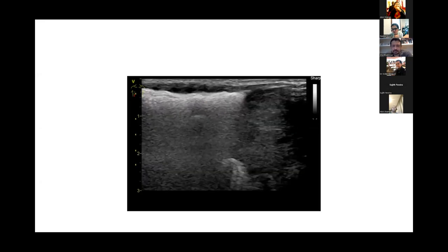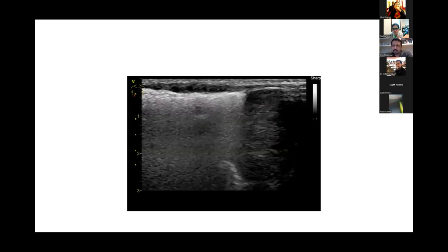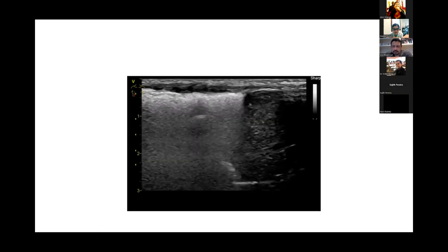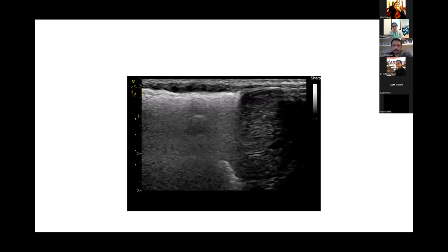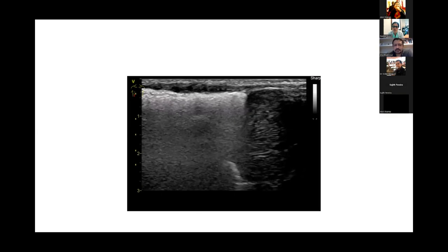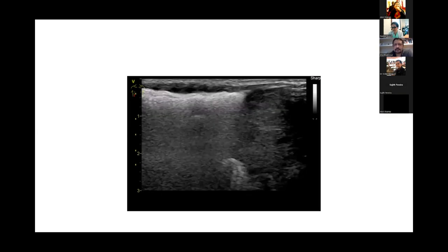And changing the frequency here would not really help you that much. Somebody asked whether we would see better with a higher frequency. Of course, the higher the frequency, the better the image you get. But is it really necessary for the lung? Not necessarily. It depends on what you're used to seeing. I'm used to seeing images with a high frequency, and in the small newborn, you're more comfortable above 10 to 12 megahertz. But this does the job, right?